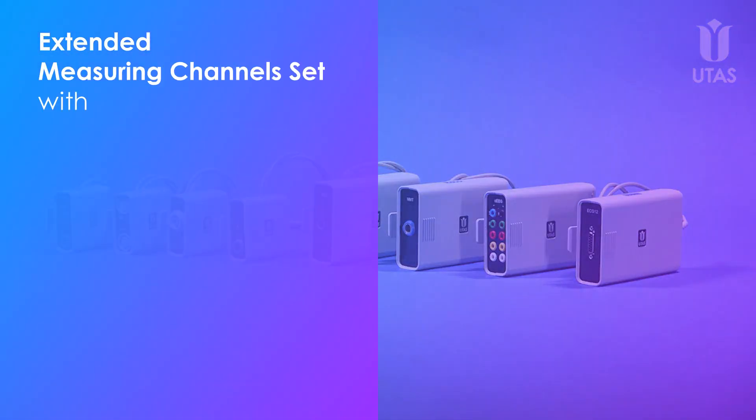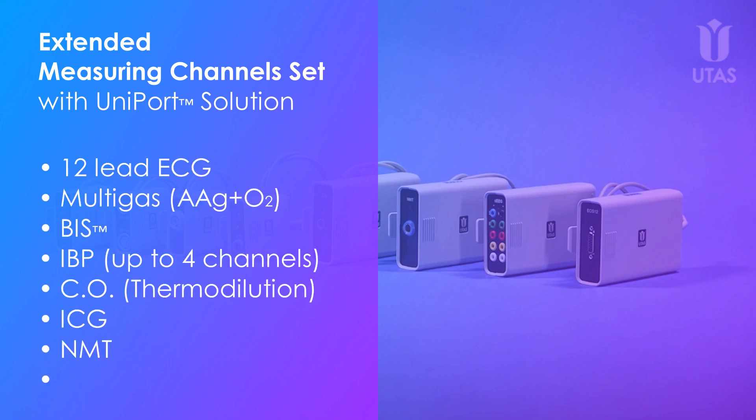The extended set includes 12-lead ECG, multi-gas, BIS channel, invasive blood pressure, invasive cardiac output, ICG, NMT, and EEG.